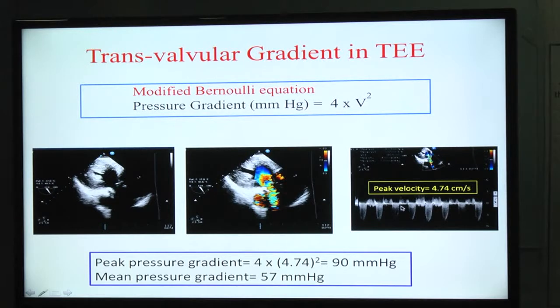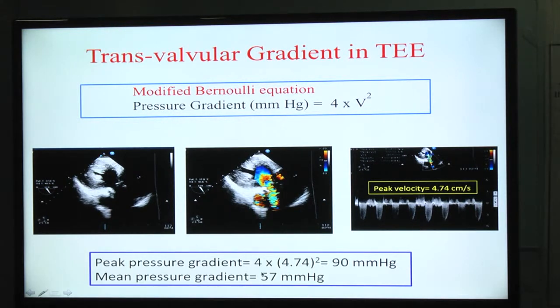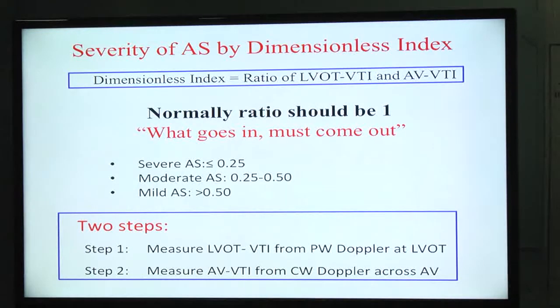Not only the peak gradient — we can also obtain the mean gradient by tracing the entire CW Doppler spectrum from beginning to end. In this case, the mean gradient is 57 mmHg. The mean gradient correlates well with catheter-derived gradients and is always used when commenting on aortic valve stenosis severity. A mean gradient greater than 40 mmHg indicates severe aortic stenosis.